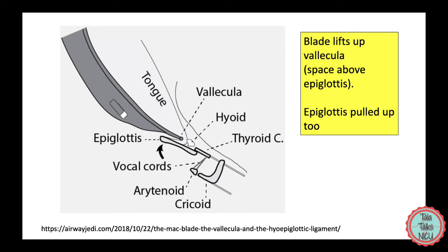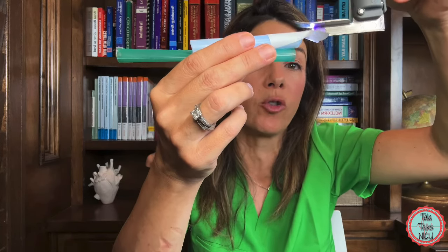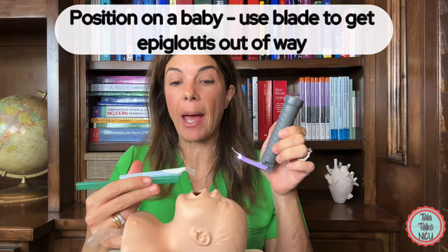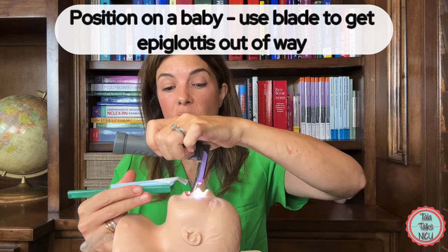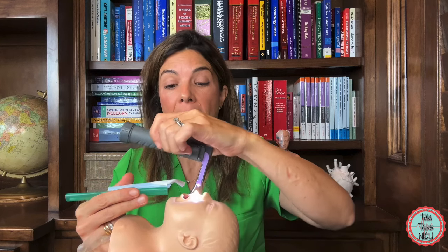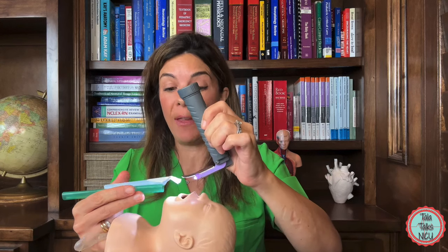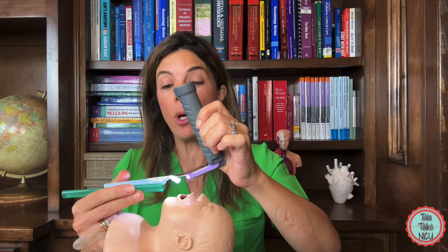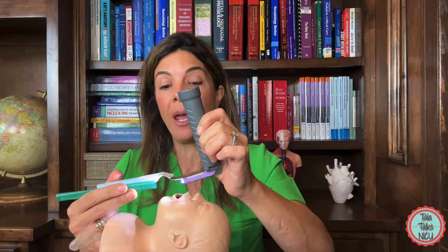When you pull up on that space, the epiglottis will pull up with it and the vocal cords will drop into view. To reiterate, let's look at that positioning on the baby again. You're going to put the blade into the mouth heading towards the back of the oropharynx, and what you're trying to do is get that epiglottis out of the way. In this bigger baby, we would be pulling up right here in the space above the epiglottis, hoping that then the vocal cords would come into view.